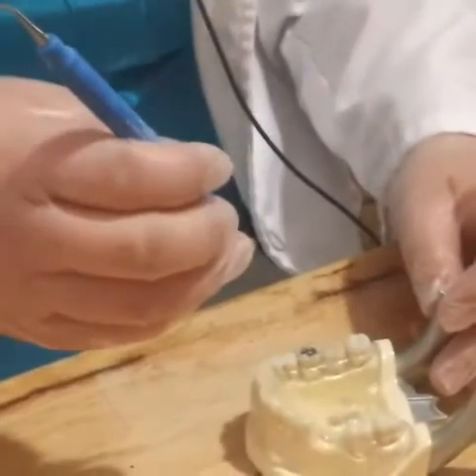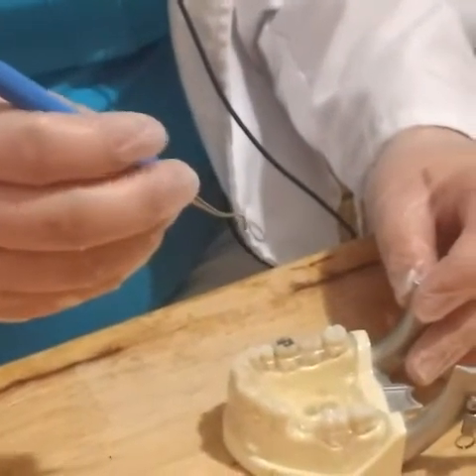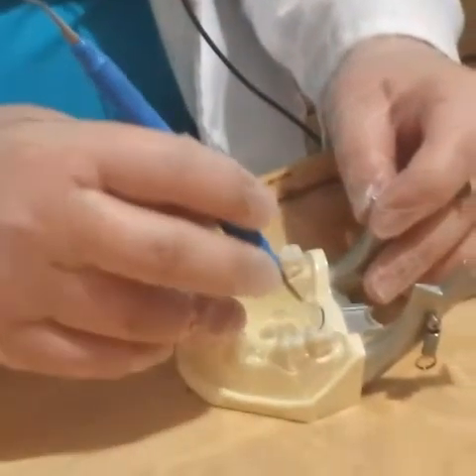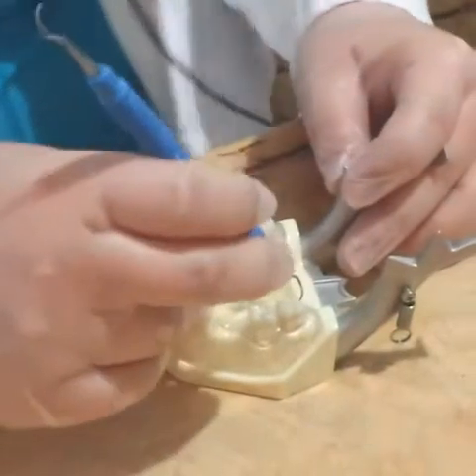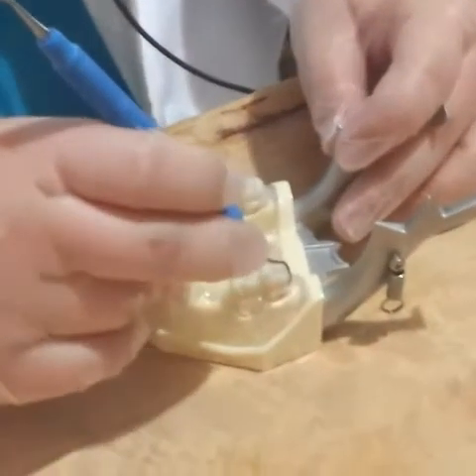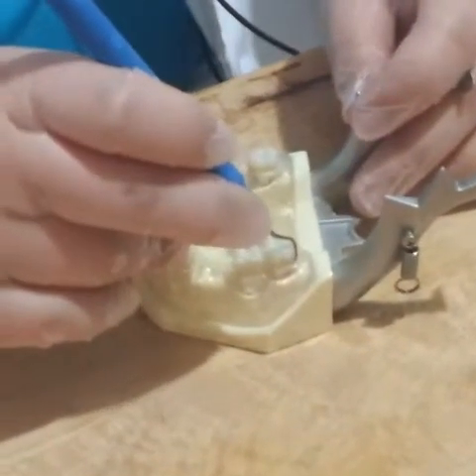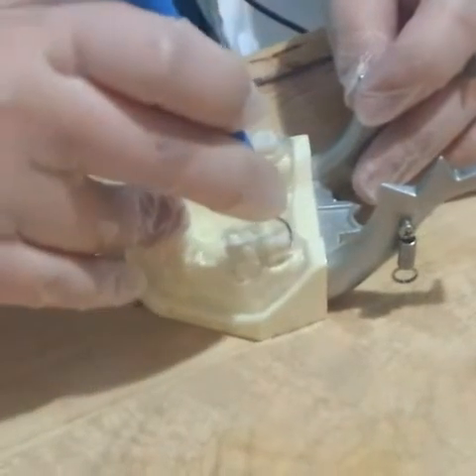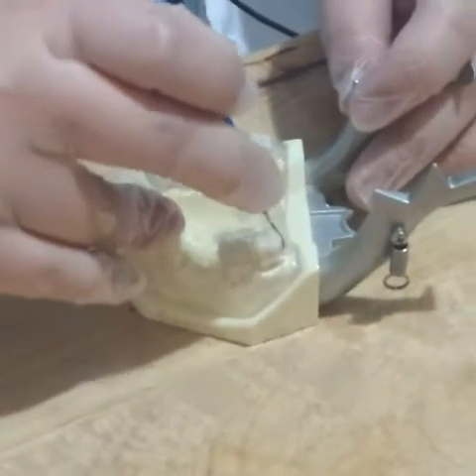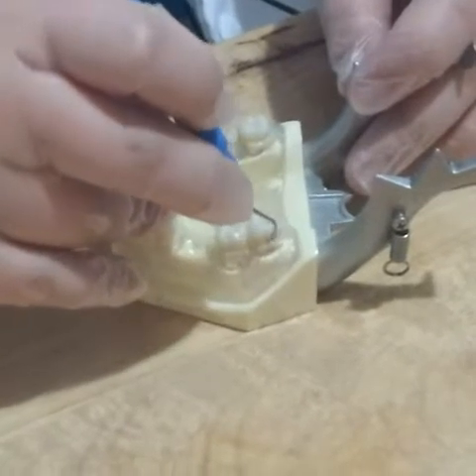Flip your instrument to the other working end and move to tooth number 17 buccal surface. Locate the distal line angle and insert the instrument toe under the gingival margin using the same sequence of steps we used for tooth number 32. Move anteriorly to tooth number 18 and continue.